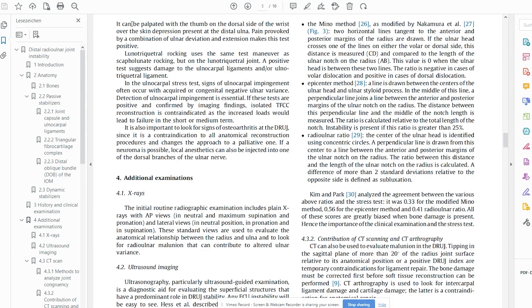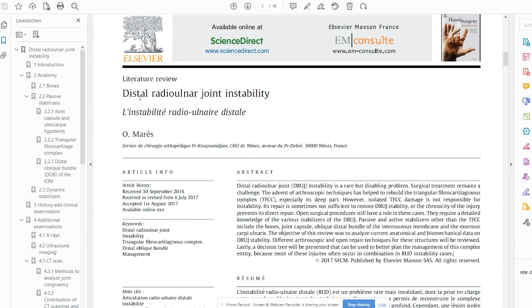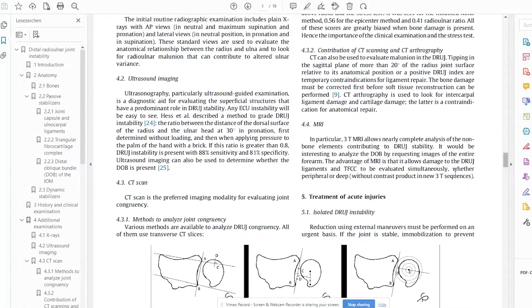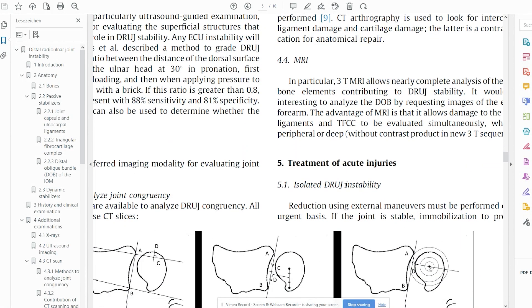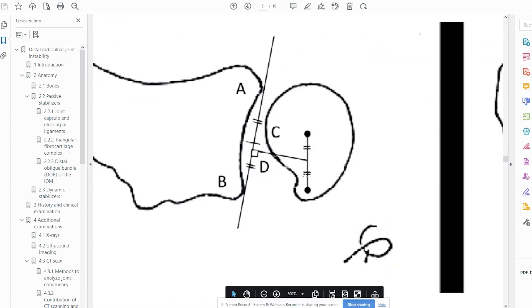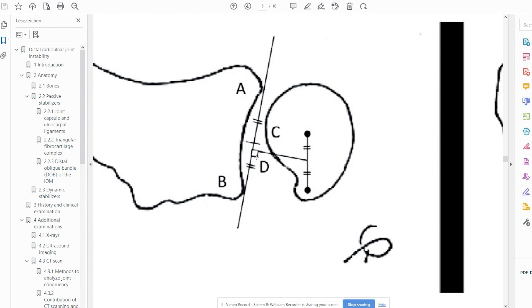Let's look at another article about distal radio-ulnar instability. Going to their illustrations, you can see the epicenter method is actually used the correct way here: center, center, line — and this time the perpendicular line is not perpendicular to the connecting line but perpendicular to the sigmoid notch line. Because it rotates around that point, the arrow always points to the center. This is how it's supposed to be.